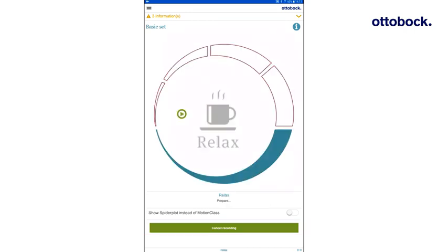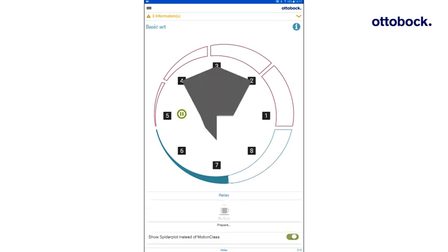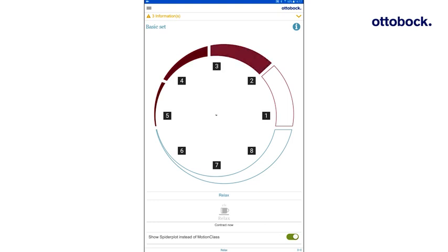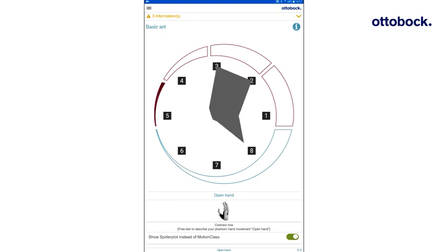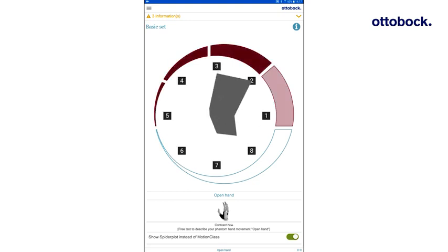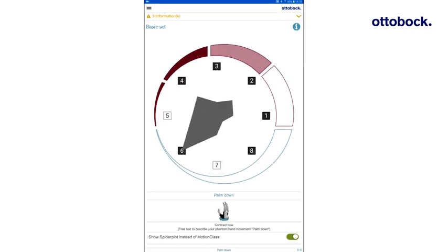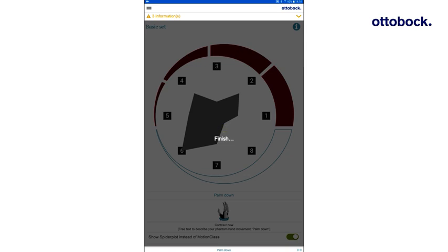Instead of an image of the movement, the spider plot can also be displayed. To toggle this feature on or off, use the switch at the bottom of the page. The display of the spider plot during the recording is used to check whether the currently executed movement pattern corresponds to the previously defined movement pattern. Set 1 is now recorded.